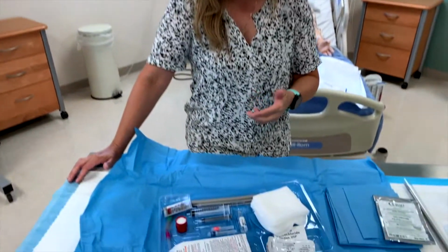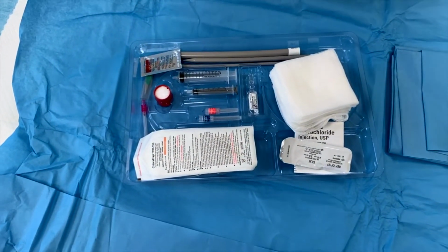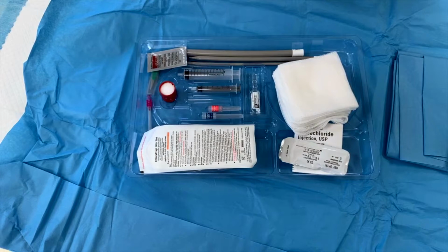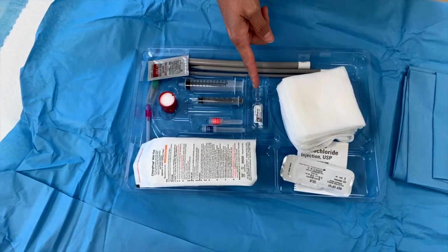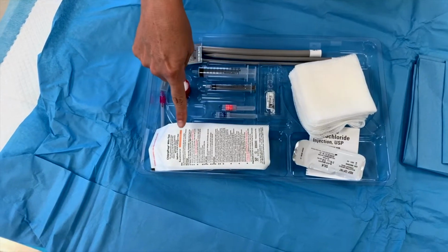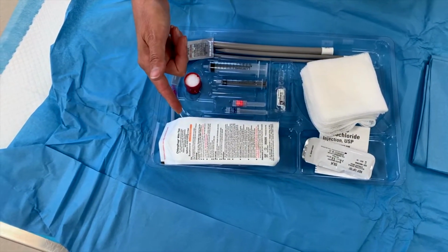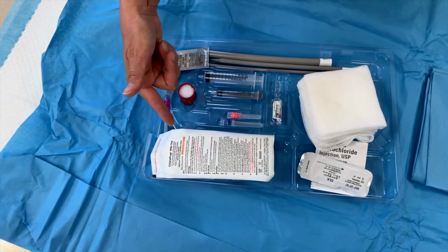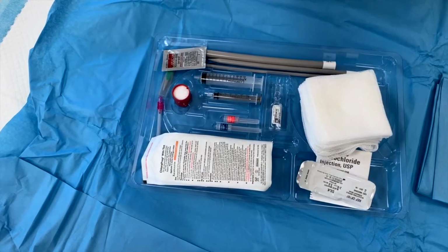When you put in a chest tube, it's going to come in a tray much like the previous tray that you saw. It's going to be all wrapped up, all right? And what it's going to be composed of is you've got lidocaine to help numb that area. You've got the ChloraPrep, so it's either ChloraPrep or Betadine. It just depends on the manufacturer. We're normally seeing ChloraPrep now to clean the site. And then you're going to see different types of trocars.